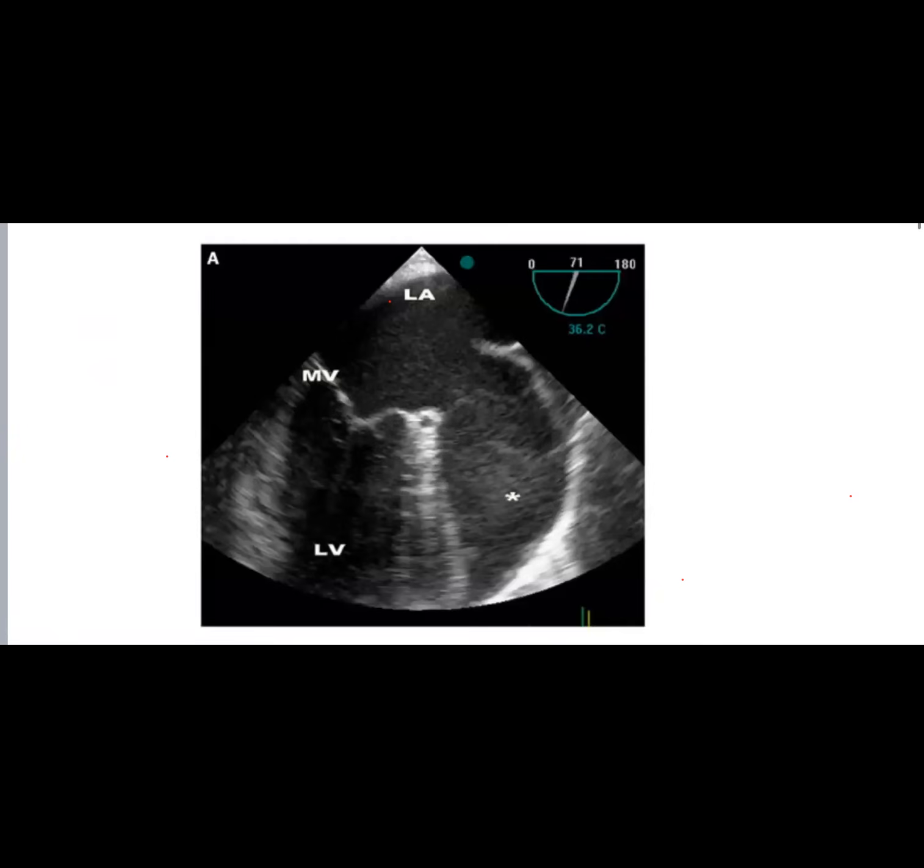Now, the other thing I want you to see. This is the LA appendage in a patient with mitral regurgitation. See how resilient, how big, and how dilated it is. That means the LA appendage modulates the LA pressure. If you have high LA pressure for whatever reason, the LA cavity dilates, but sometimes the LA appendage dilates even more.